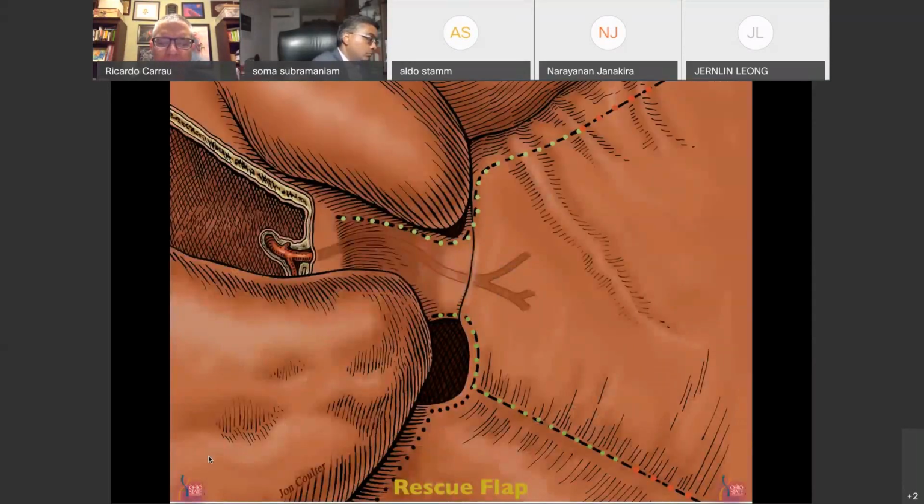The other thing that has changed over time is that in 2006, when we started using the nasoseptal flap, I was using it for 85% of our cases. The reason for that was that the nasoseptal flap pedicle, as you can see here, in between the natural ostium of the sphenoid and the posterior choana, will be sacrificed if you do a posterior septectomy and a wide sphenoidotomy. So we were raising the flap at the very beginning to avoid damaging the pedicle.